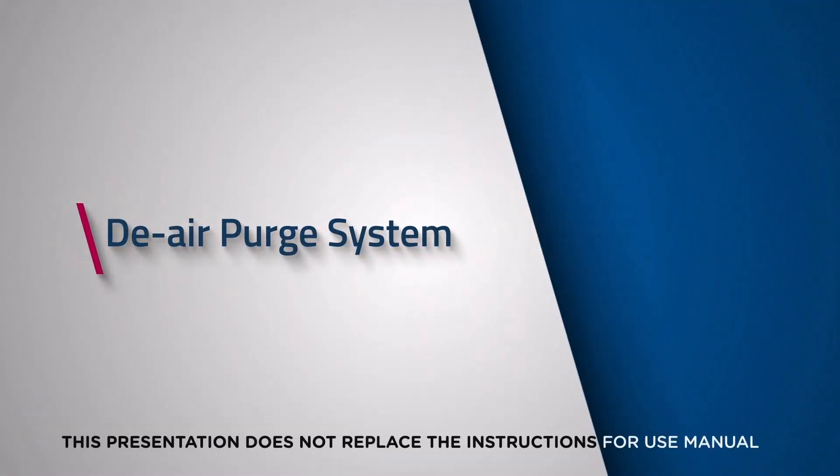This Impella Skills video is designed to demonstrate how to complete the de-air purge system procedure for the automated Impella controller. This presentation does not replace the instructions for use manual.